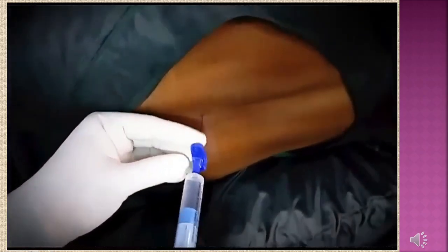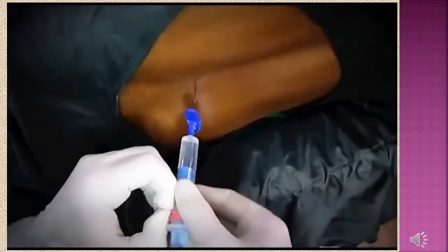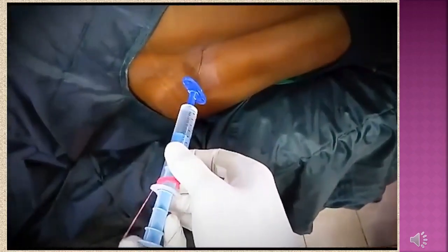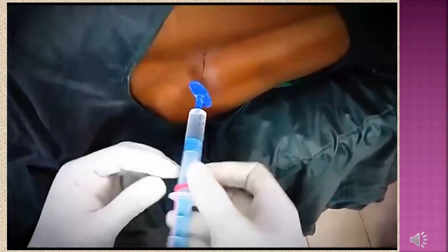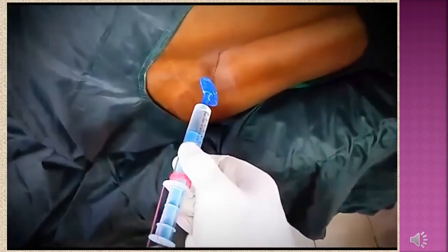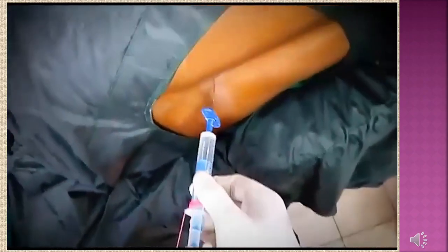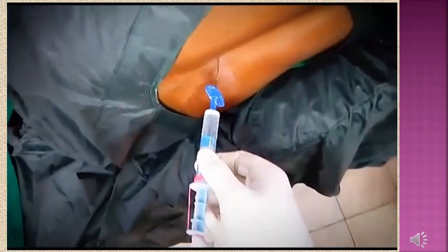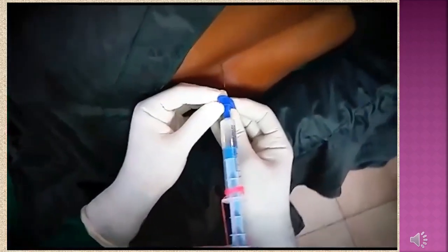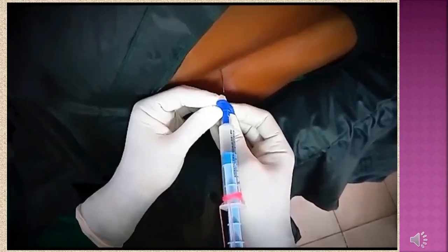The rubber bands are stretched and they are attached on the slots. As the slots are well symmetrical to each other, after application of the rubber band, symmetrical force is applied on the plunger. After attaching, we need not worry, because the needle is in the interspinous ligament and the dura is away from the needle.